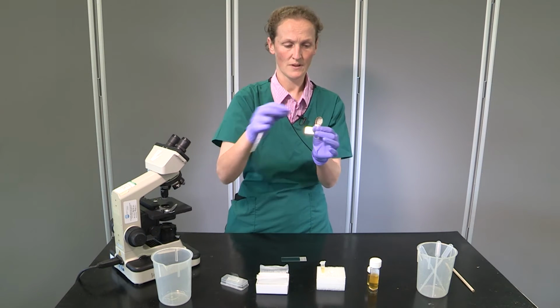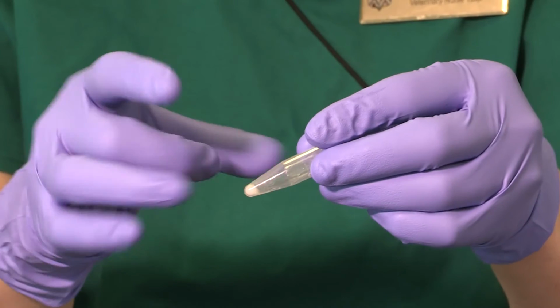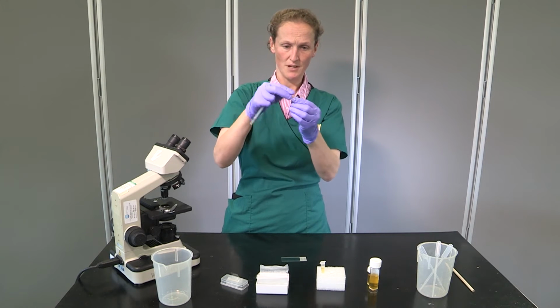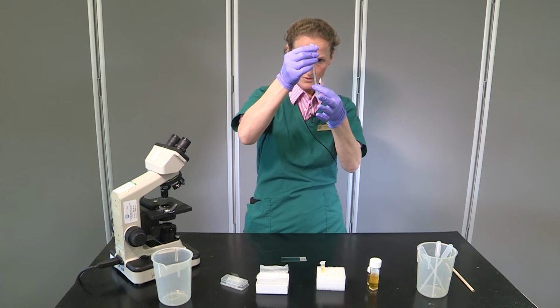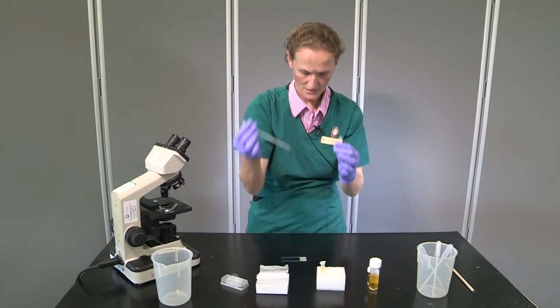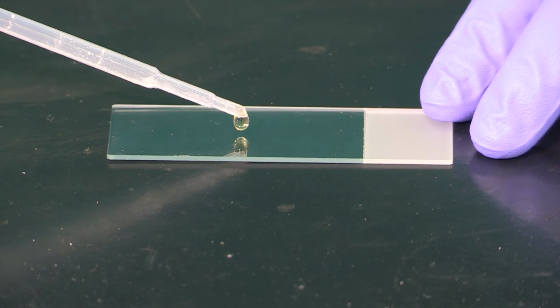Okay. And then we're going to resuspend the sample by giving it a flick. Okay. And now I'm going to take my sample out, take a drop of it into the pipette, place it onto my microscope slide, like so.